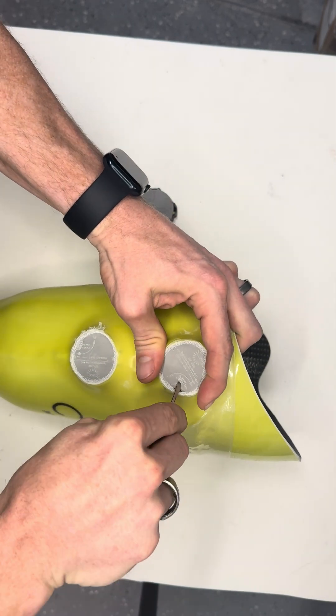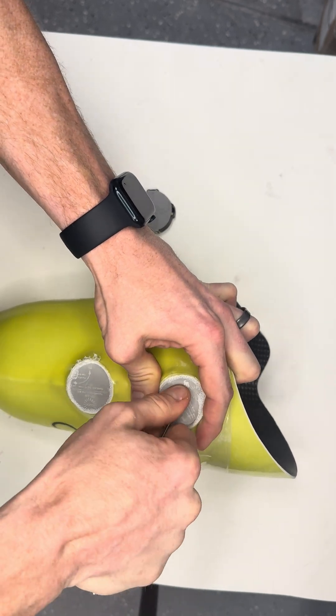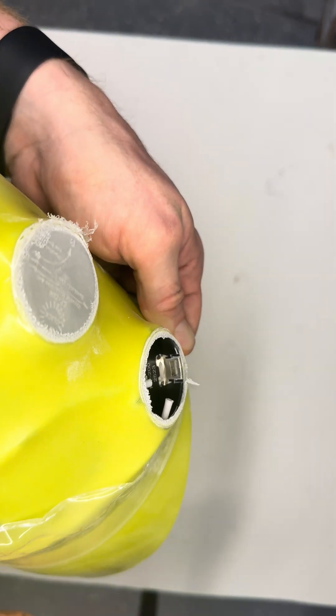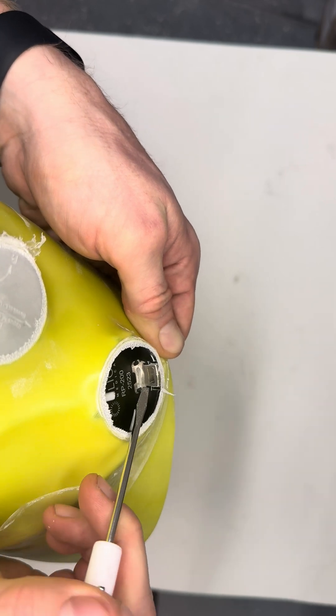once you remove that dummy, don't stop grinding at this level. Make sure that you grind all the way to expose this little metal element right here — we call that the metal bridge.